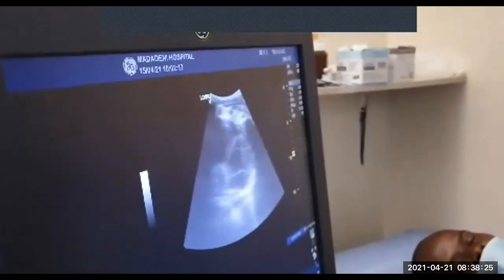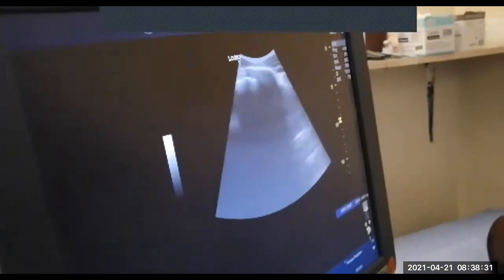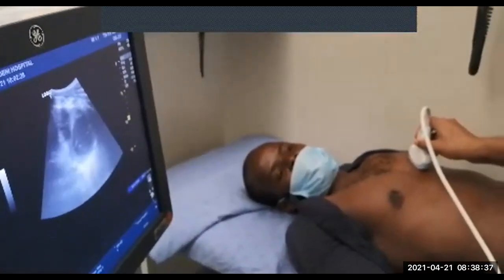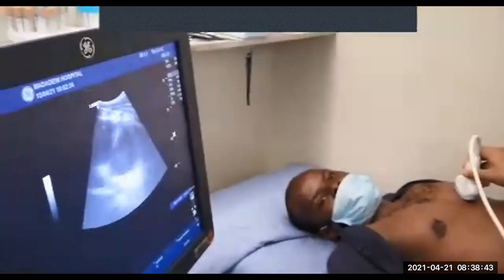There we can see it a little bit better, all right? We can see our septum, we can see everything. So we start to get a clearer picture of the heart. As you come closer to the sternum though, you lose it a little bit. So this is normally where you'll see the best picture. So we see right ventricle and we see left ventricle. That's where the short axis is of great value.